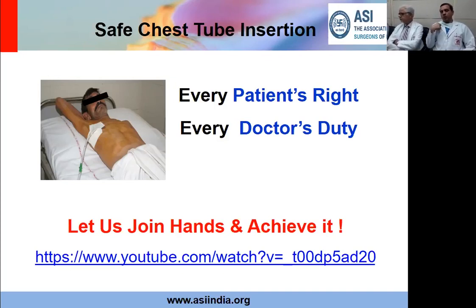If you remove the chest tube and you find that there is post-removal pneumothorax, you decide to observe. 48 hours later, you do a chest x-ray and find that the pneumothorax has increased or the patient is now tending to become a little bit breathless and it's time for you to reinsert. You would reinsert from a site one space above or below, a little anterior or posterior, but not from the same site. Because then you increase the chances of infection. There is increased chance of peritubal leakage because this wound will already be macerated. You have nicely mentioned how to fix the tube. And I think this is very crucial.